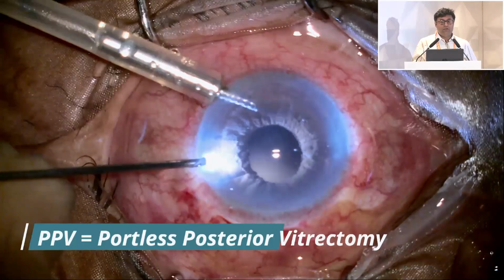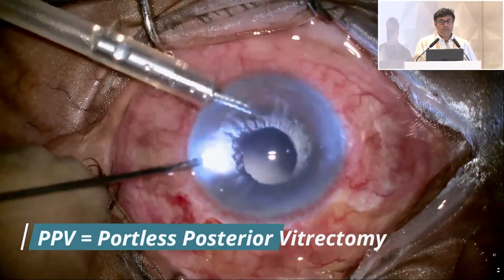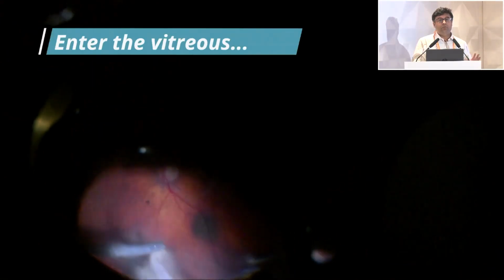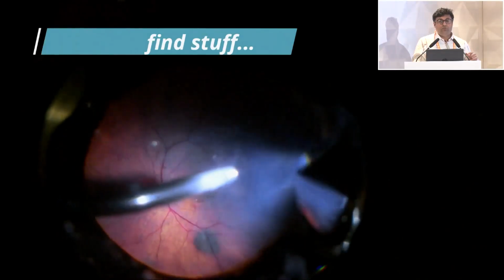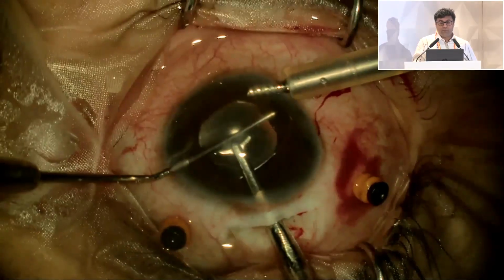Now this is what I did that was unusual. Instead of doing 3-port pars plana vitrectomy, I did a 3-port limbal vitrectomy. I made all the 3 ports at the limbus and put in the light pipe. You can actually do this maneuver even under topical anesthesia. Because you're not making pars plana scleral ports, you can get away with even managing posterior dislocation of the lens through limbal ports. So I call this procedure PPV, but it's not pars plana vitrectomy, it's called portless posterior vitrectomy, wherein you make all the 3 ports at the limbus and not through the pars plana.